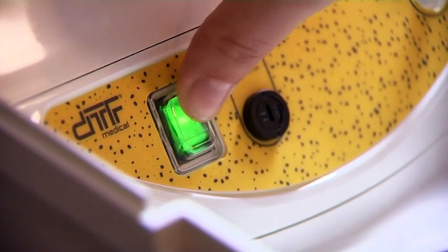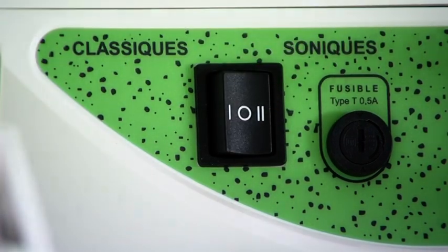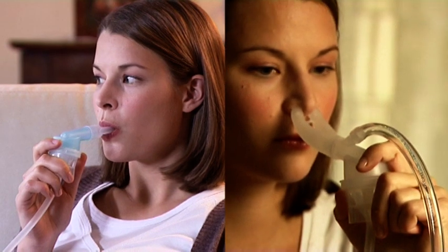Switch the compressor on. Place the mouthpiece in your mouth between your teeth and close your lips. Or select the sonic mode on the compressor and place the nosepiece in your nostrils. Make yourself comfortable and breathe calmly and naturally.